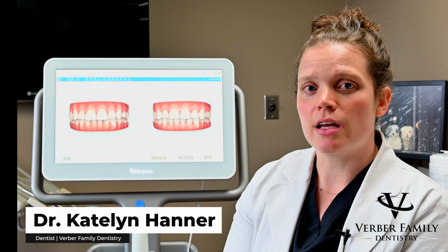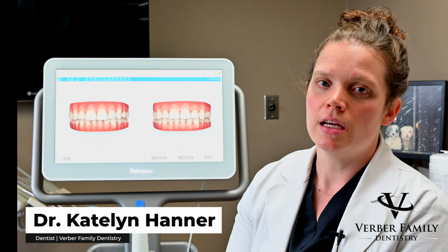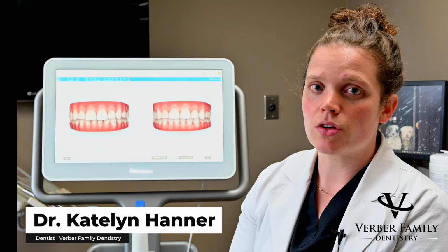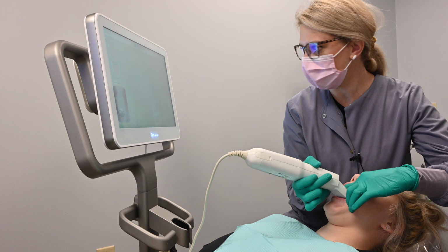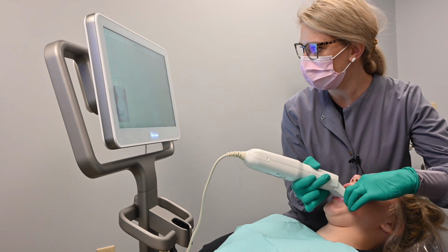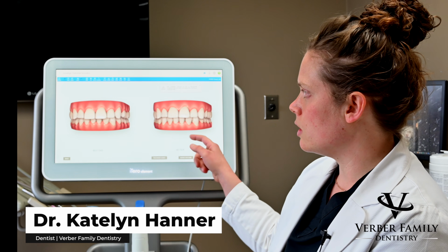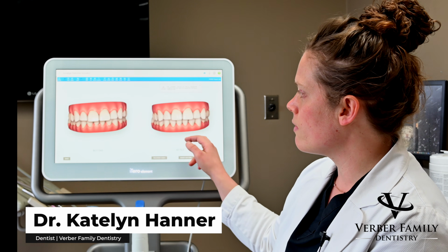So when we see a patient, a lot of times it could be through a hygiene appointment, or it could be just a new patient that is interested in Invisalign treatment. We bring them in for an initial consult. At that consult, we'll do a scan of your teeth as well as take photos of the teeth. Both of these are needed for the full Invisalign treatment plan, and ultimately when we decide how to move your teeth. This is an example of how we can take a look at where your teeth start and where your teeth could end with everything.